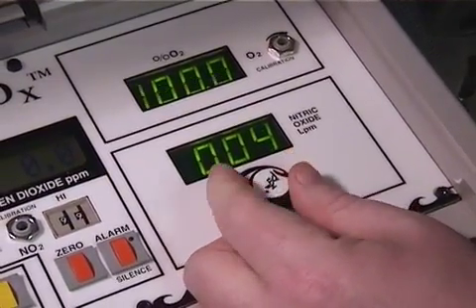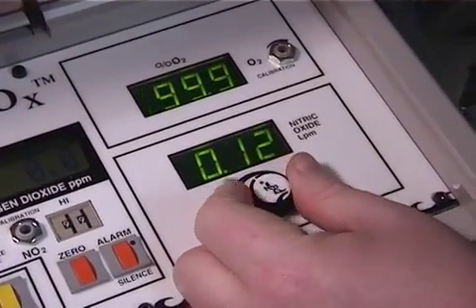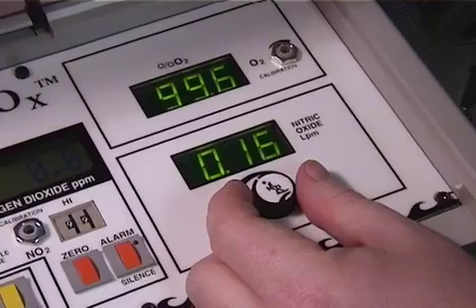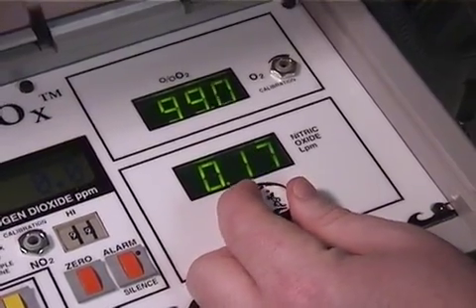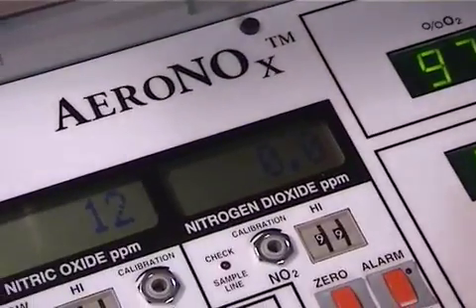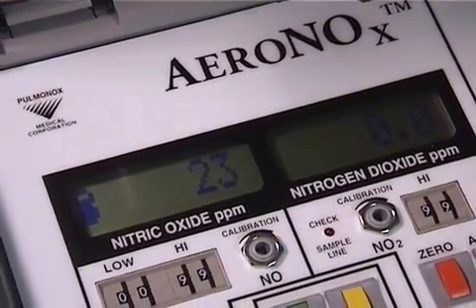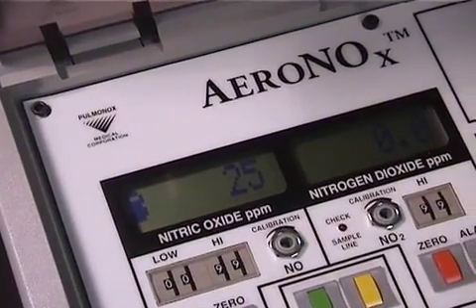To deliver the nitric with the Aranox unit, turn the digital flow meter dial counter-clockwise to about 0.15 to 0.17 and watch the values on the meters climb. The nitric should settle at about 20 parts per million. Titrate for whatever value you need.